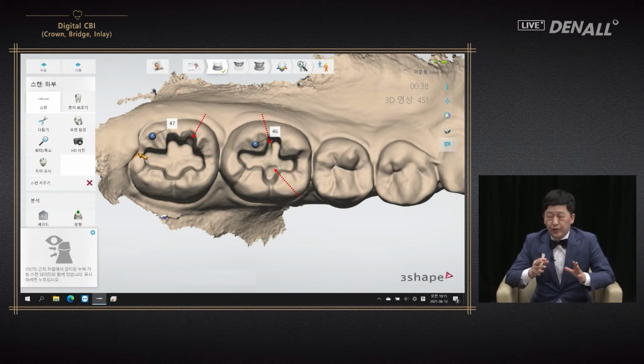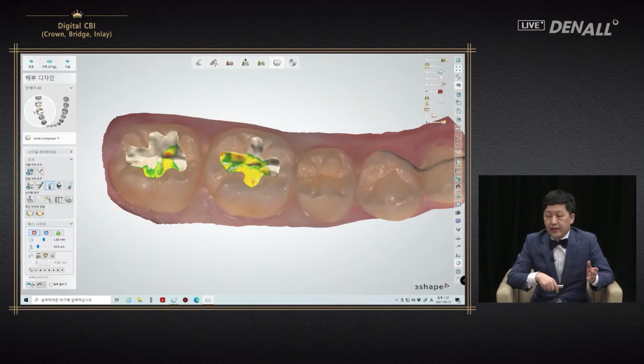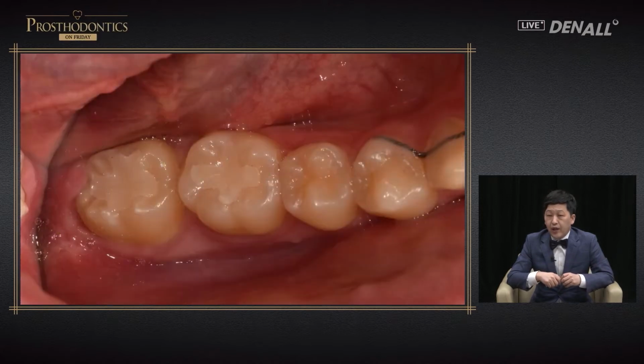You cannot see the differences clearly using impression materials, but using digital technology after scanning, you can check what is insufficient. You can adjust once again and do rescanning very easily, and impeccable preparation is possible. This information is sent to design PC and final design is done. After that, milling is done and inlay is tried in within the oral cavity.